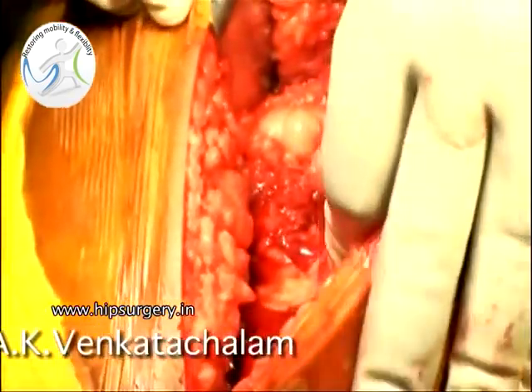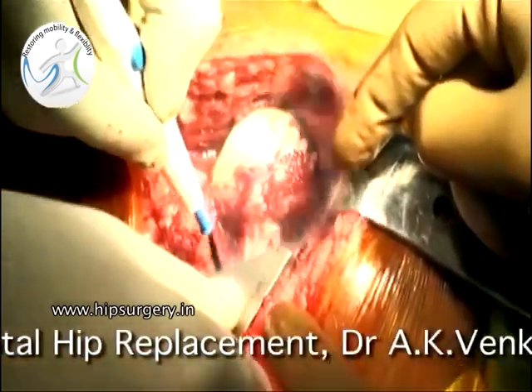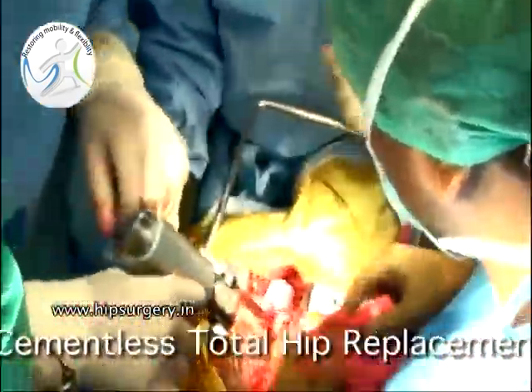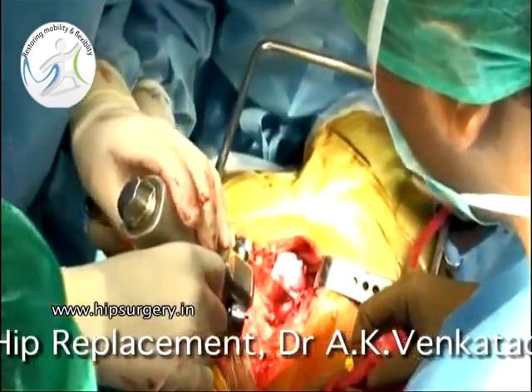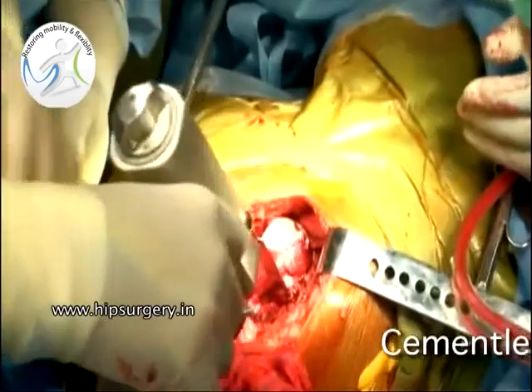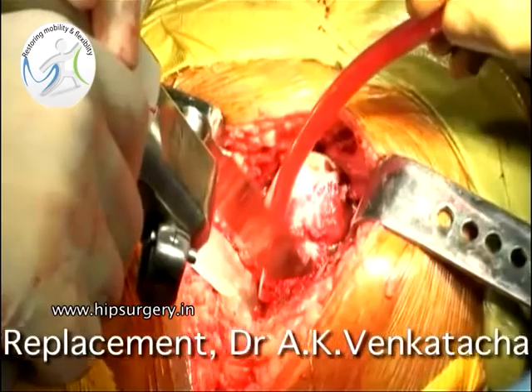The hip is dislocated easily as the posterior wall is deficient. The osteotomy level is marked with the bovie, and the neck is osteotomized with an oscillating saw. The head is removed, and bone from the head will be used later as a bone graft.